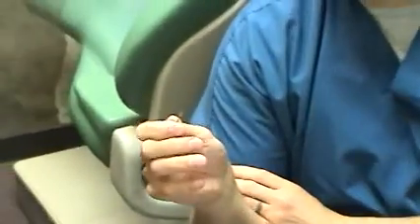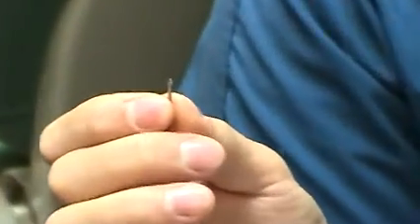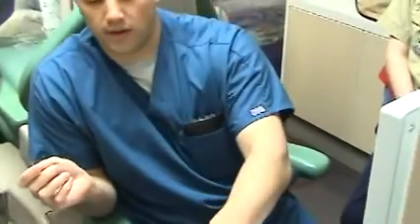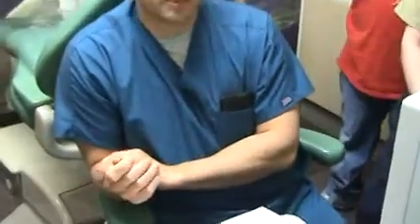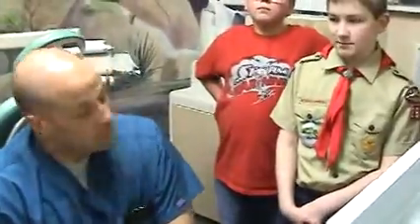One of the drill bits that we use, or burrs is what we call them, some are impregnated with diamonds, and then we also have some that are carbide. Here's an example of a carbide burr. It's just a highly polished piece of metal. It's not diamond impregnated. They're actually not that expensive. Tiny little diamonds aren't that expensive. Around one of these burrs, you'd expect to spend anywhere between $4 to $8. But still expensive for such a small thing. It's not totally cheap, but it's not going to break the bank either.